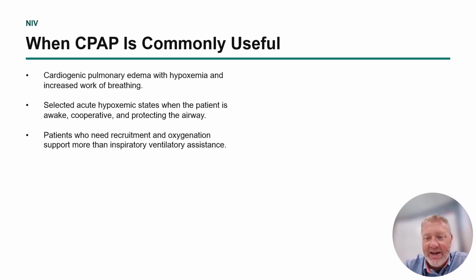Now that may not come into as much play when you're en route because you're always there with the patient, but still, if they're obtunded, if they're somnolent, then tube them. They need to be awake and alert to be on CPAP or BiPAP.